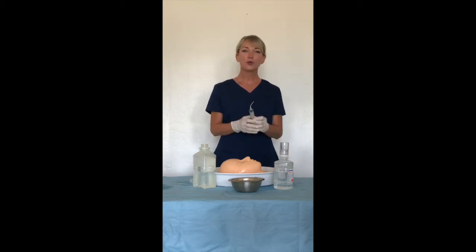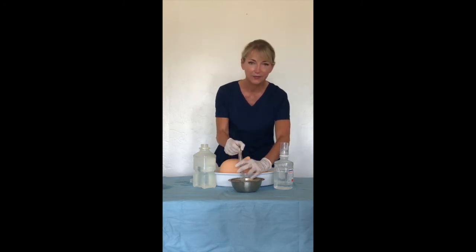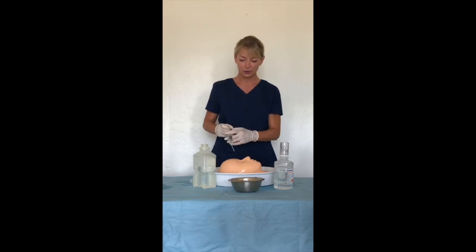Now let's look at another method used for wound irrigation in the ED, a syringe with an IV catheter tip. Again, I'm going to fill the syringe with fluid, place it over the simulated wound, and deliver it. Look at what a mess it makes. There's absolutely no protection for you from any sort of splashback.